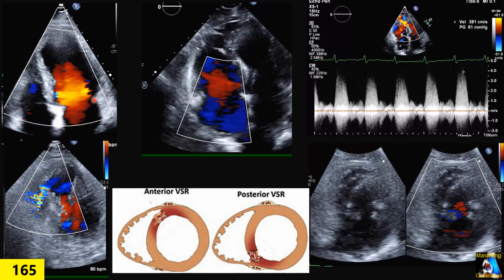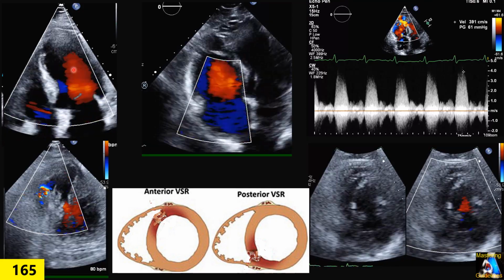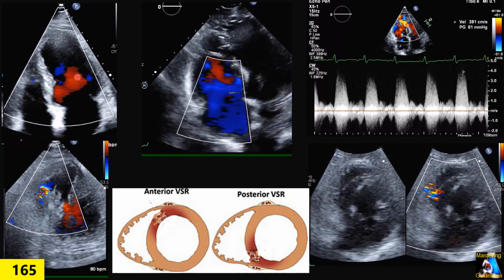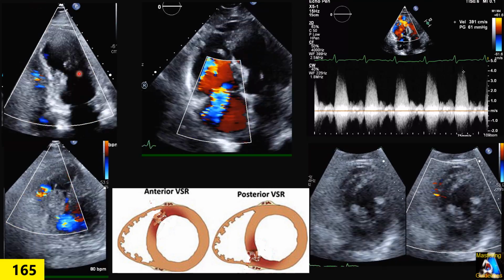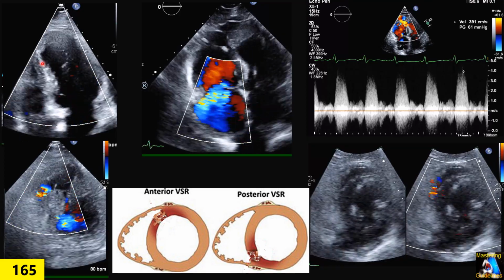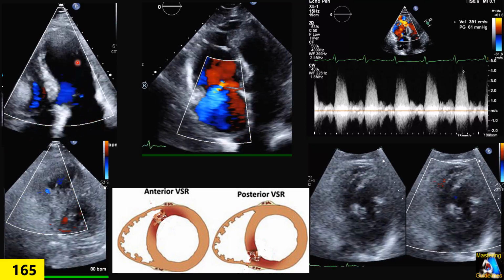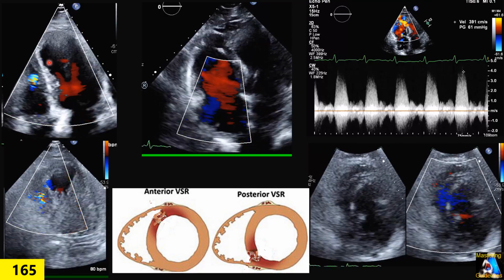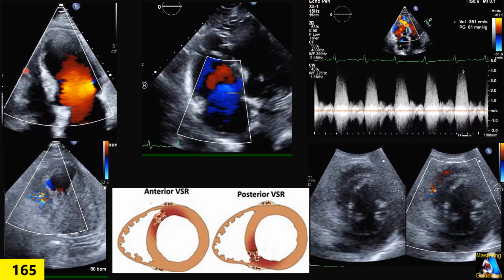If it's on the left side, it can be, for example, hypertrophic obstructive cardiomyopathy at this level. If you put continuous and we have obstruction, it gives you a dagger or saber pattern that you can rule out with the Doppler. Otherwise, 100% it will be a shunt, an intracardiac shunt, that at the beginning is usually left to right.